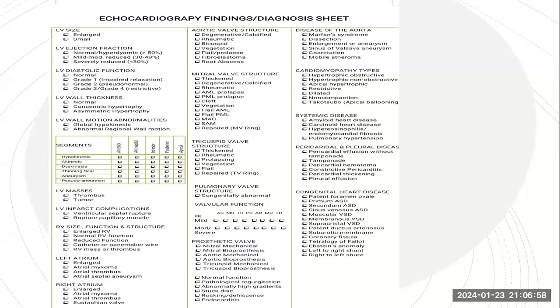The second advice is that you need to have a photo memory for this sheet, so easily when you are in the exam, you know where the diagnosis is. For example, if you are looking for constrictive pericarditis, khalas, you go immediately, with no need to spend time looking for where the diagnosis is in the sheet.